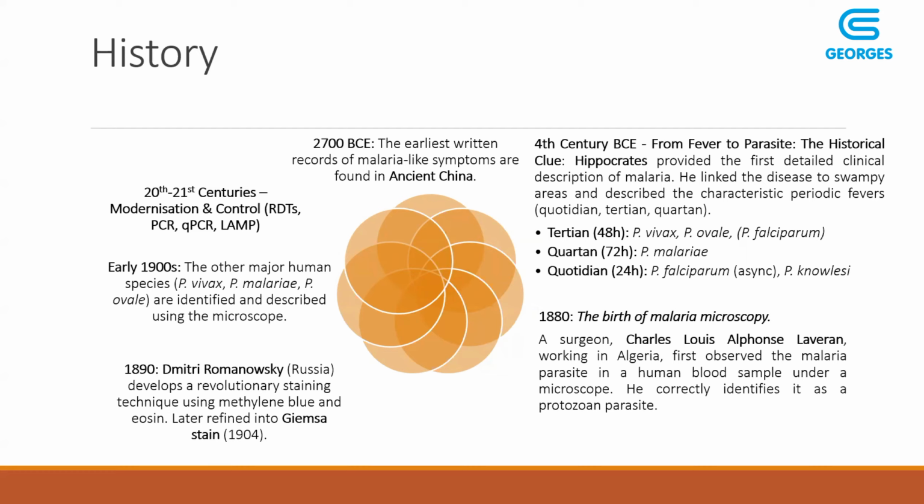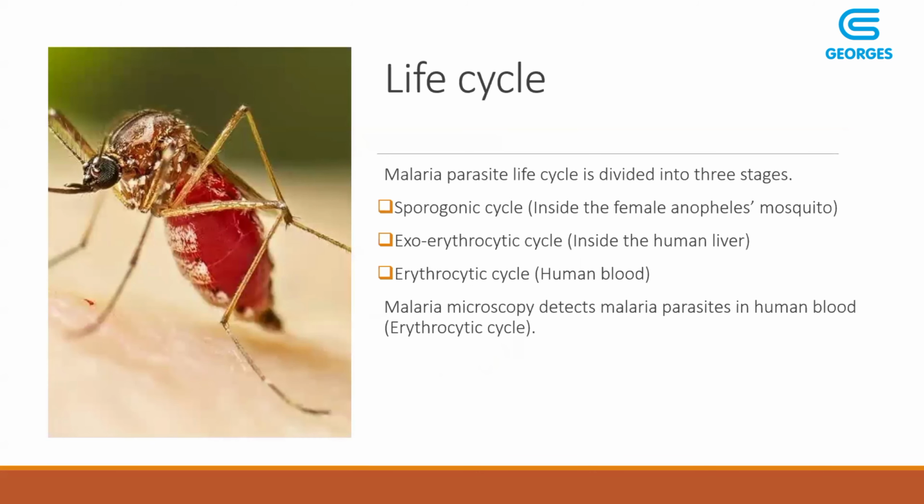So this is just a brief history of malaria, general malaria, and how microscopy came about. To understand what we are looking at in a blood smear, we also need to understand the life cycle of malaria.